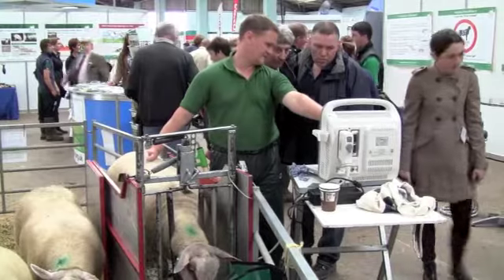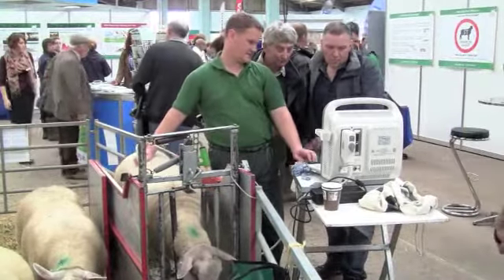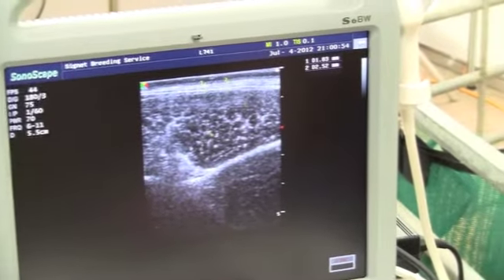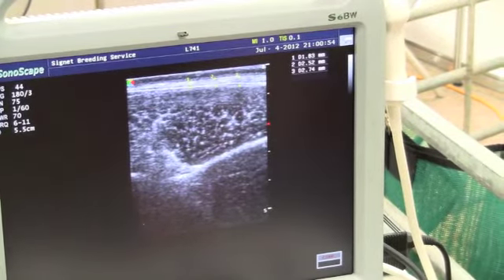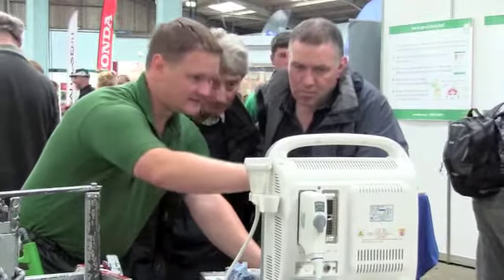We do the measurements in line with the deepest point of the eye muscle — 3 fat measurements to take an average, at centimetre intervals. And then the deepest muscle point itself.